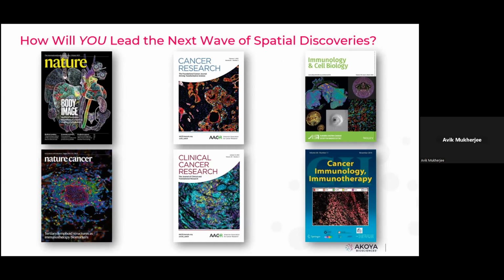Yeah, Xenium first. People have been doing this, also the same with CosMx: CosMx first, then PhenoCycler. Yeah, you can see the whole protocols.io, they have given step by step everything that they did. And they can do H&E. So with every PhenoCycler run, after you have done your IF, you can take off the flow cell and you can do H&E.